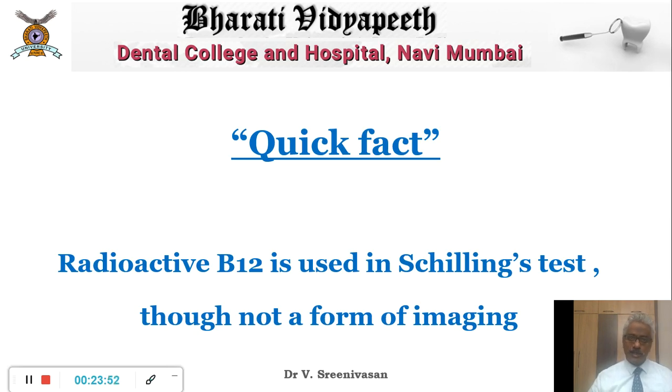So radionuclides are again a fantastic idea of imaging, and it really calls for the ingenuity of man to utilize various naturally occurring radioisotopes, creating new isotopes, and managing to understand the disease process and become better at identifying biochemical processes of disease and identifying disease before it manifests in morphological terms.